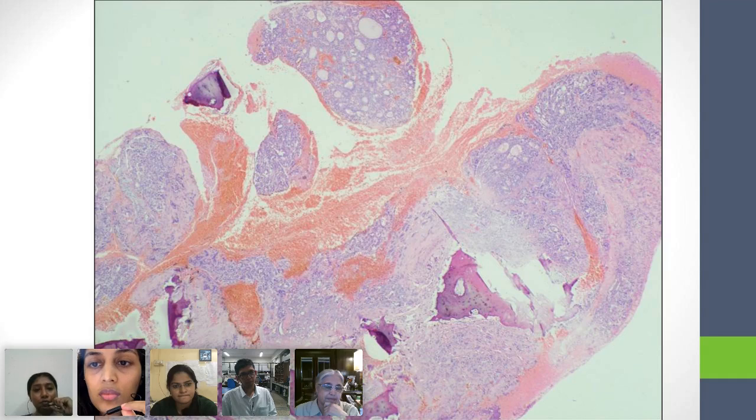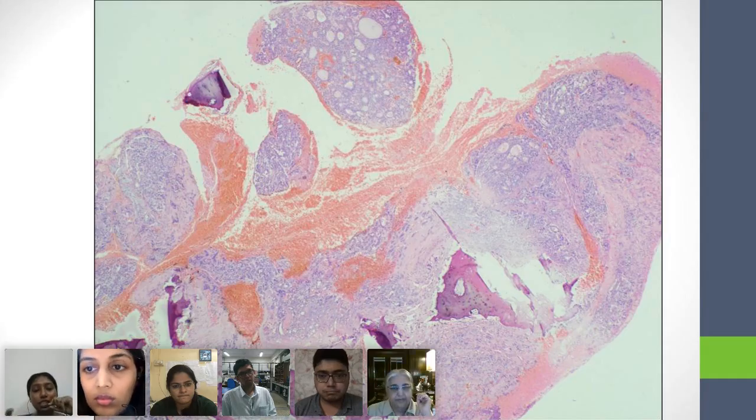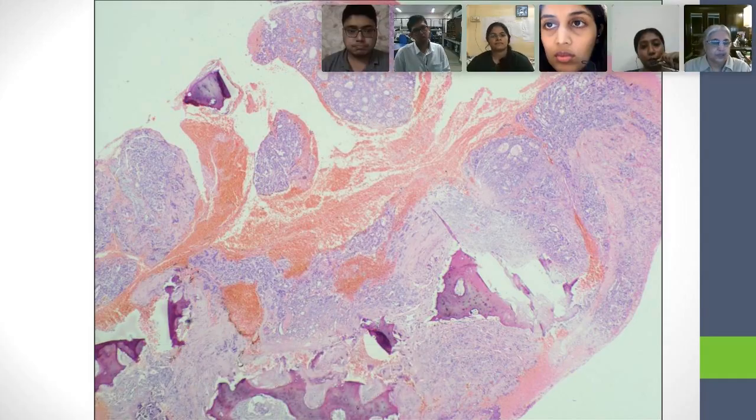So we have a tumor arranged in diffuse sheets with multiple cystic spaces, which is seen invading into the bone. Okay. So you see normal tissue, that's the bone, right? Yes, and you see a tumor that is in sheets. And now it looks like sheets with some spaces filled with some secretions.